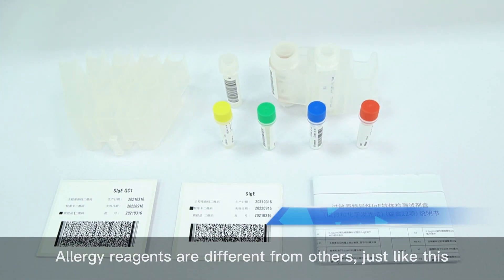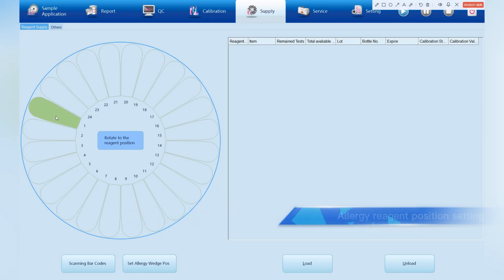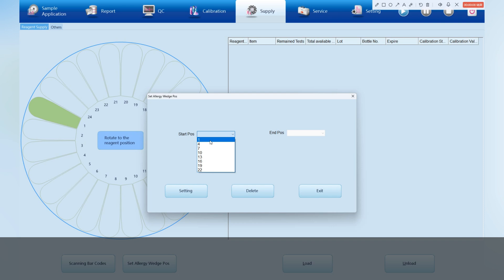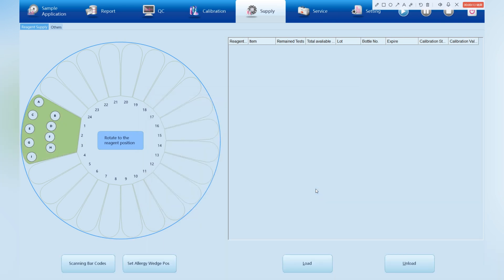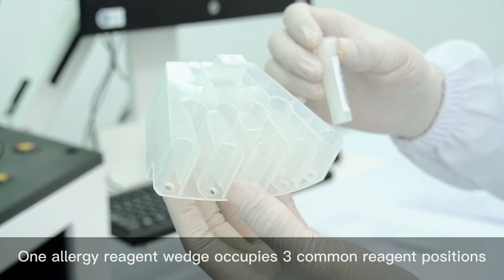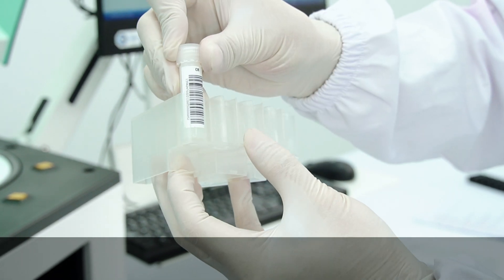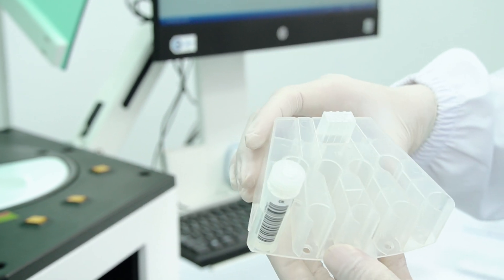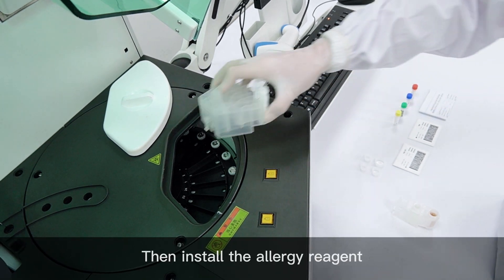Allergy reagents are different from others, just like this. Click the Set Allergy Wedge POS button and select the corresponding positions. One allergy reagent wedge occupies three common reagent positions, but it can hold nine allergen items. Then install the allergy reagent.